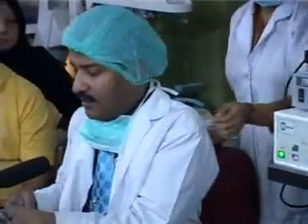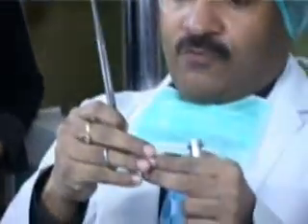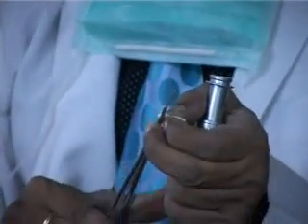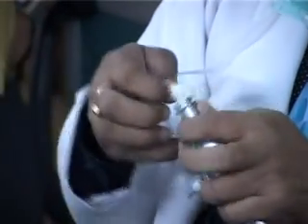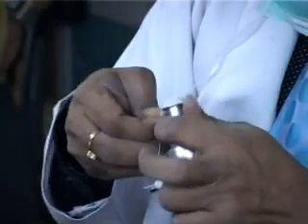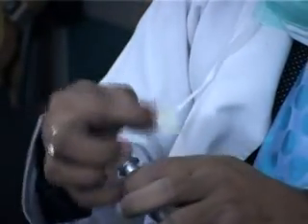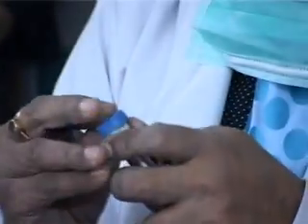You cut the gloves here, like this. Cut the glove finger, right? And again you fold it and cut the glove finger at this point, very small, like this. And your valve is ready. Now what you do? You put it here, like this, and then just in the center, nicely it will fix, and then fix this torn valve here. Can you see? And then put this torn valve over this.